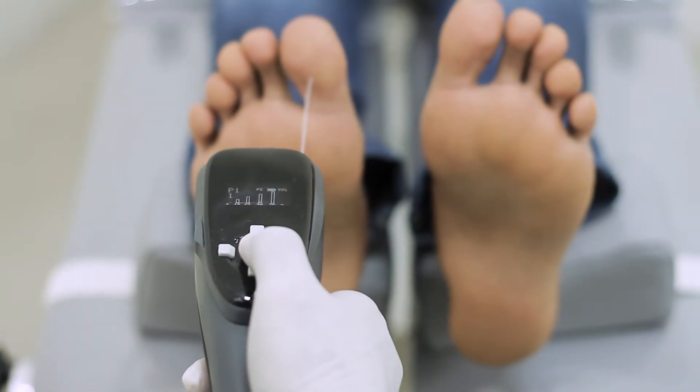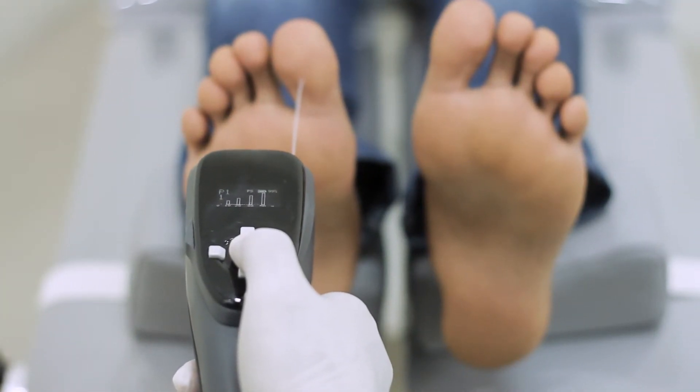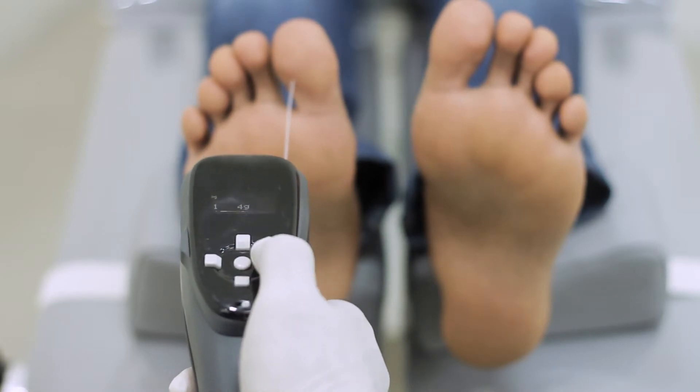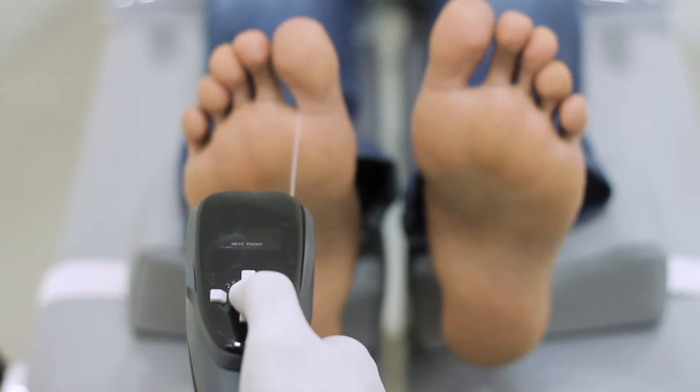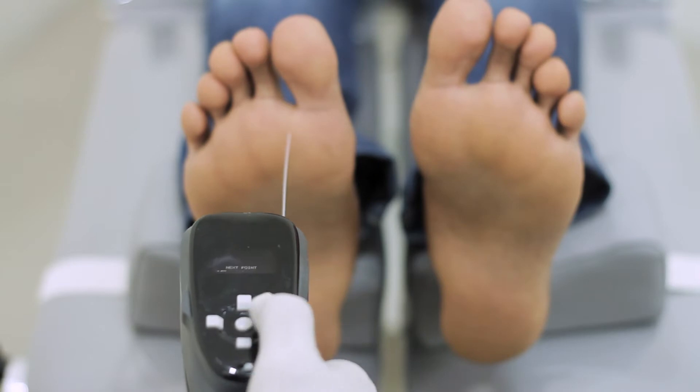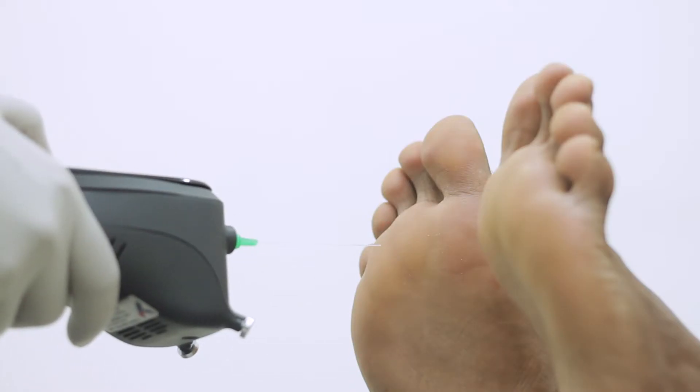Perform the test on the subject by gradually pressing the monofilament against the selected test point on the foot. Ensure that the monofilament is placed at right angles to the skin surface.